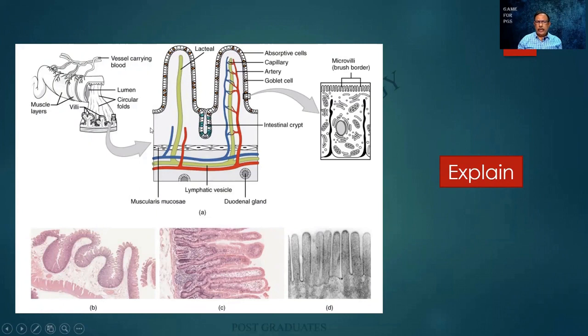already seen. I will not be going into that. But then there is a villus. Starting from the duodenum, you have got long finger-like projections called the villi. And they will be having a slender fibrovascular core that is loosely supported by the lamina propria. And the cells on the surface of the villi will be either columnar or they will be goblet cells. Towards the large intestine, there will be a greater amount of goblet cells, and towards the small intestine, there will be the columnar cells. These are called the villi.